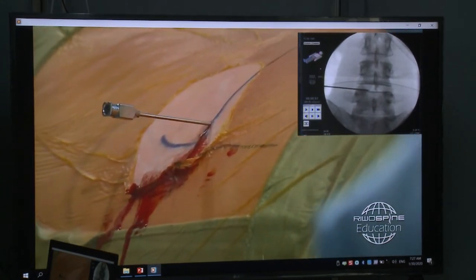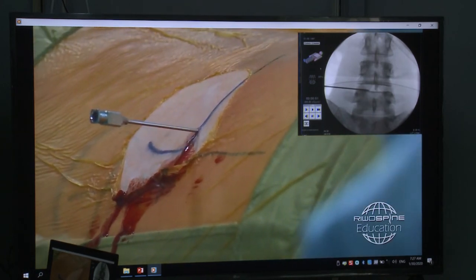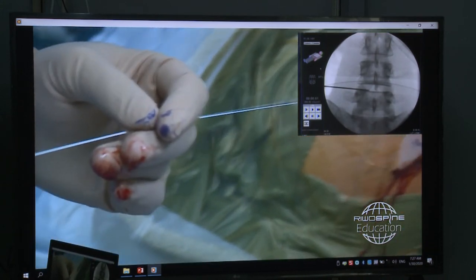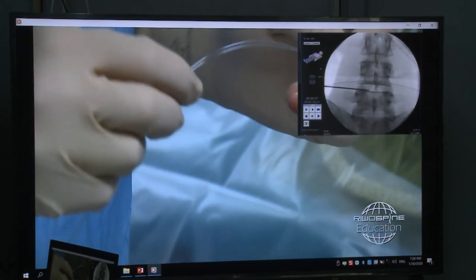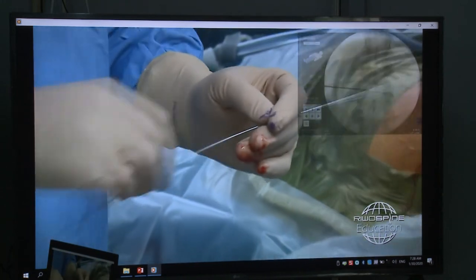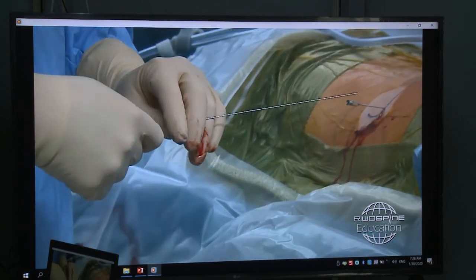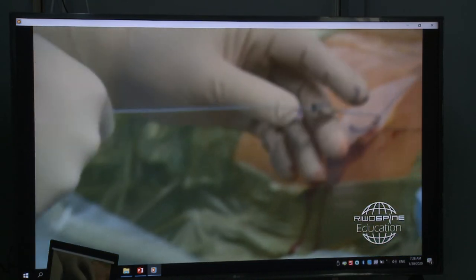Removal of the mandrin. And then we introduce the guide wire. Be careful, the guide wire is flexible. That means when we introduce the guide wire and then try to push over the dilator, make sure that it is not bending, because when it is once bent, you are not able to push the dilator further over the bent part. Either you push the complete guide wire into the patient, but normally it is not possible to get past this bent part with the dilator, and then you have to remove everything and start again.